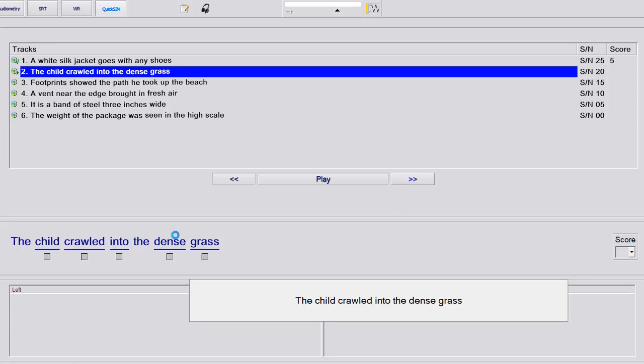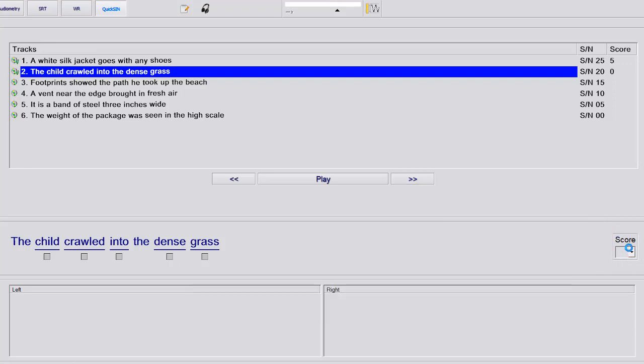Or you have a drop down here on the right hand side where it says score, and you can just drop down and select how many they got correct, and then hit the next button here.